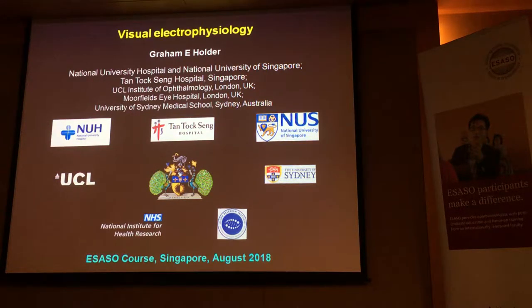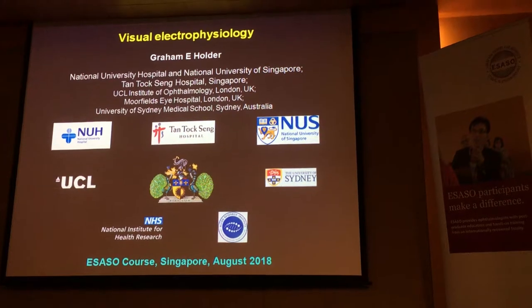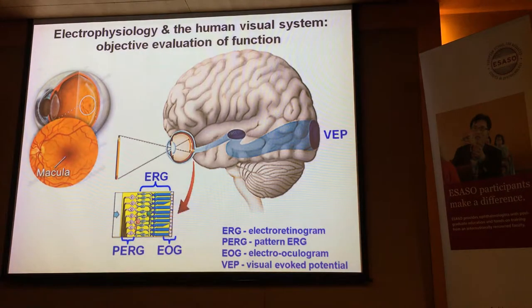Because if you don't understand what electrophysiology is about, how it's formed, where the symptoms come from, you can never understand how to apply it to the management of the patient. And that's what it's all about. Because electrophysiology gives us an objective evaluation of function, not structure. We all know about structure, and there's been massive improvements in structural abilities in imaging and whatever over the last 20 years or so. But this will tell us about the function.